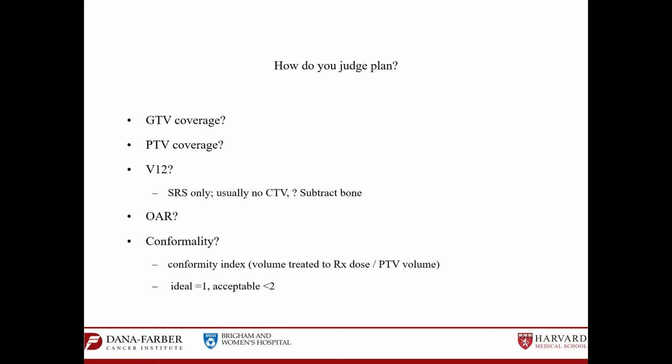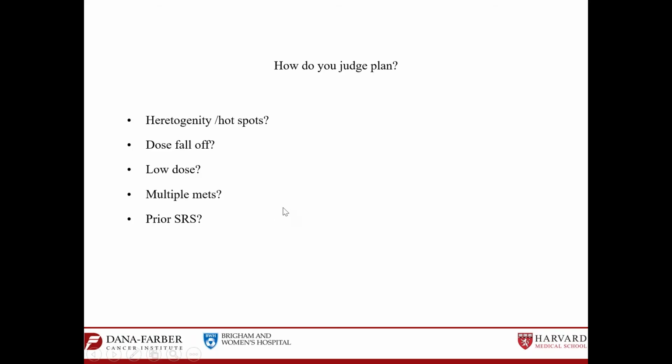So it depends on whether your priority is to protect the organs at risk, so you're okay with the hot spots, or you just have some space to cover, so you will take care of the hot spots not to exceed 150% or 140% for the stereotactic radiation. If you're doing cavity radiation, make sure hot spots do not exceed more than 115 to 120% of the prescribed dose, because again, you are radiating normal tissue. You are not radiating a tumor.